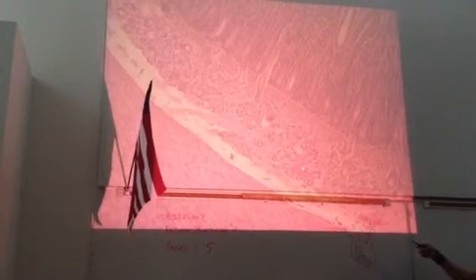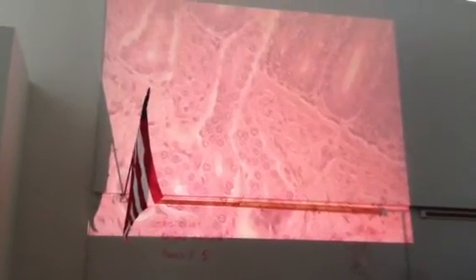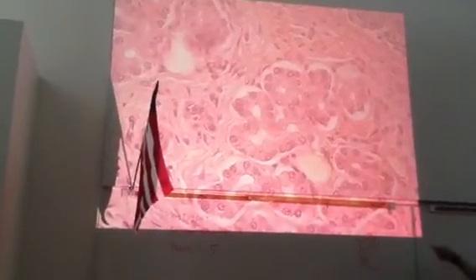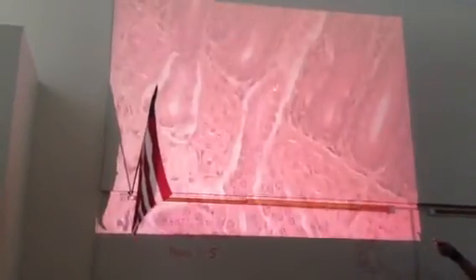And here we are in submucosa, and there's Brunner's glands. And they are everywhere, all the way around. I haven't tried to show you each space, but guaranteed, they are everywhere, all the way around. So that's simple cuboidal epithelium of the gland, and we actually see some of the duct going on its way out, like right there. So that tells me I'm in duodenum.